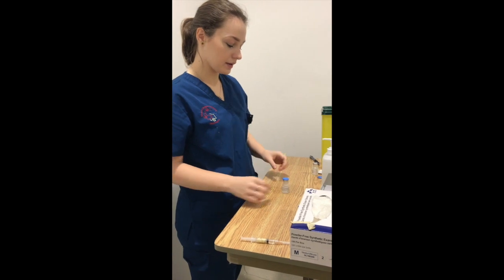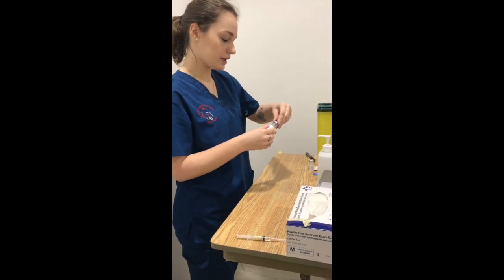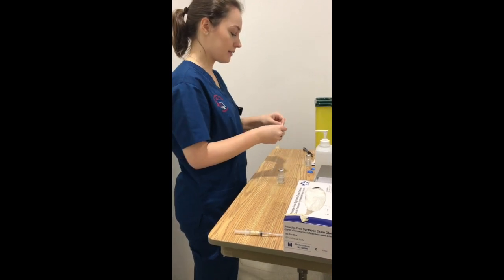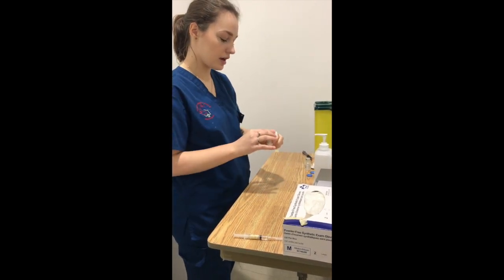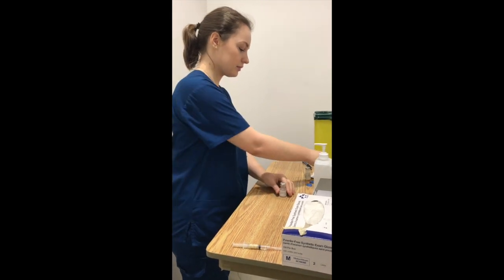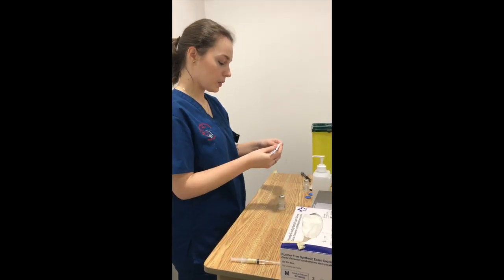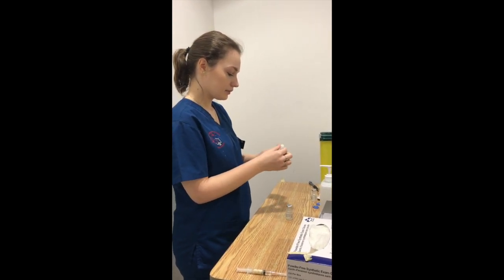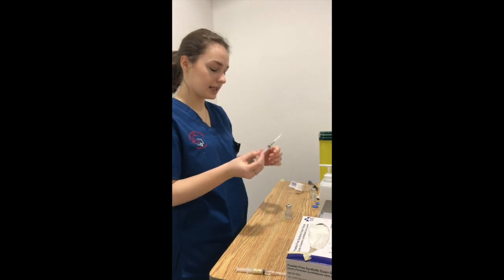So next we're going to be doing the Haldol. So we have the vial here. We're just going to, again, remove the cap, and we're also going to sanitize the top again. Again, just making sure everything is kept sterile. Then what we're going to do is open up our 22 gauge needle. So again, same technique as last time.